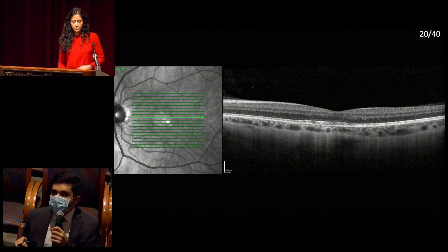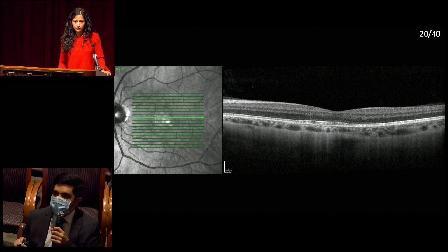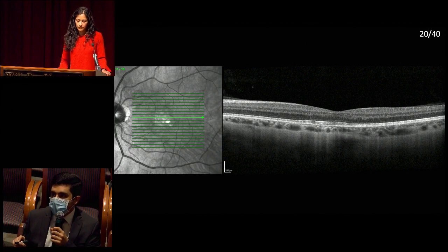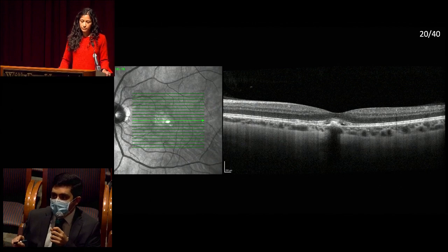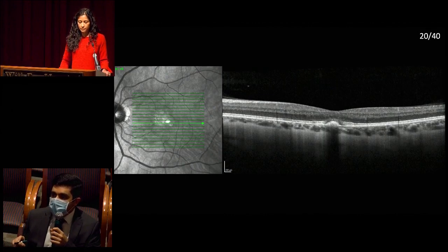In the left eye, the horizontal OCT through the macula at 20-40 vision shows normal vitreous, a thin choroid consistent with myopic changes. Inner retinal laminations appear intact. In the outer retina, there is some thickening of the inner digitation zone. The ellipsoid zone overlying it appears intact, as does the external limiting membrane. More inferiorly, through the lesion seen on color photography, there is hyperreflectivity at the RPE level with associated subretinal fluid — no intraretinal fluid — and thickening of the inner digitation zone surrounding it.